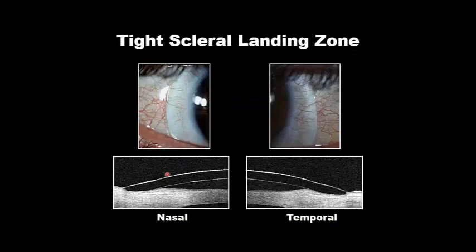So what's happening when we have this blanching is this underlying surface angle of the sclera may be flatter than the normal angle of your ICD trial lens or your custom lens. Notice how the edge is pointing into the surface, not along the surface like this. Also notice the apex is into the conj, maybe by 80%, only 20% above. So this whole relationship of angle of scleral landing zone to angle of underlying surface isn't optimal for this eye.